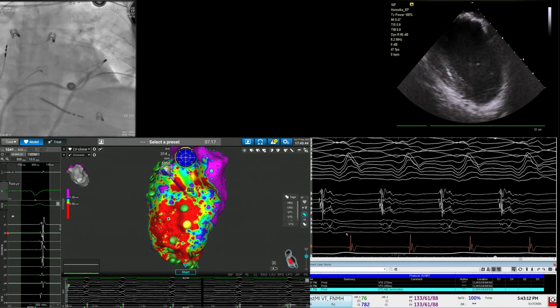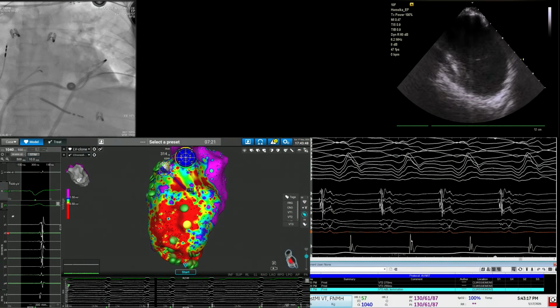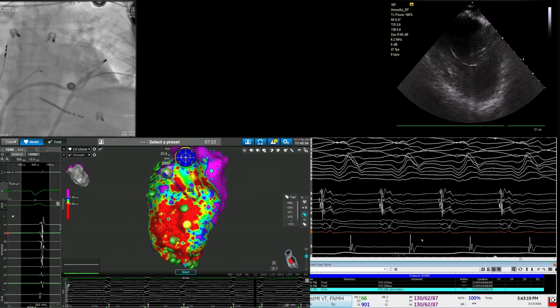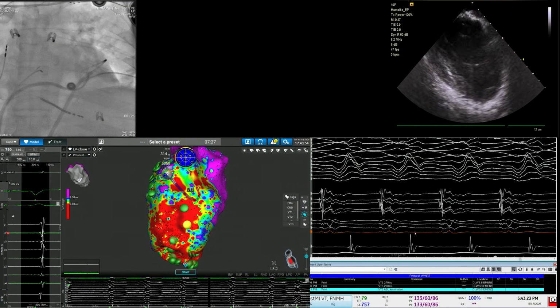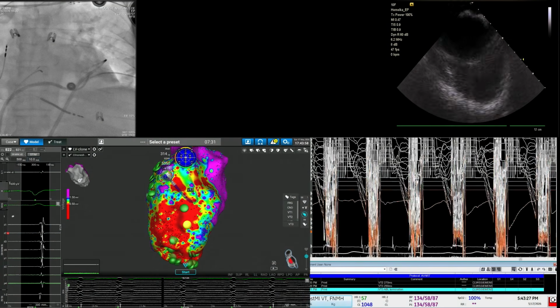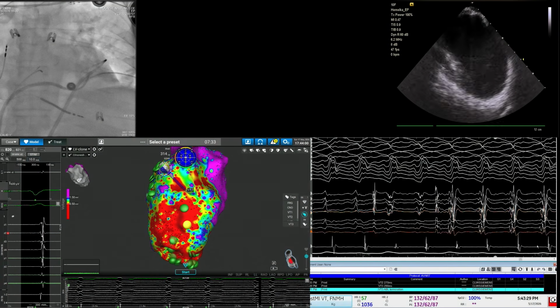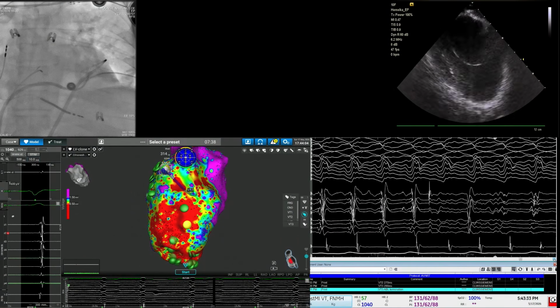Okay. Now the electrogram there doesn't look terrible. It's again pre-systolic, I would say. But it is a much higher voltage amplitude. And ablation here didn't do anything. So let's drop to 100 sweep speed again, and then scroll to the left. So ablation didn't terminate. And then I moved down to where the yellow dot was, where we had a better electrogram.